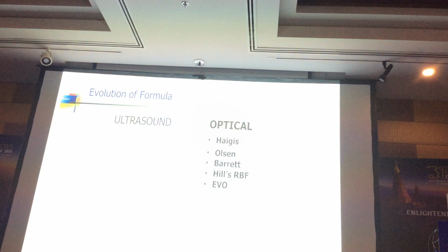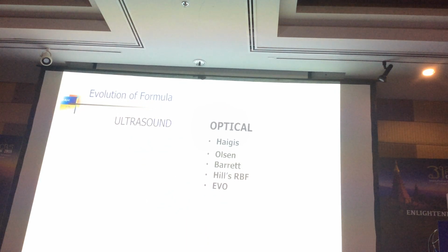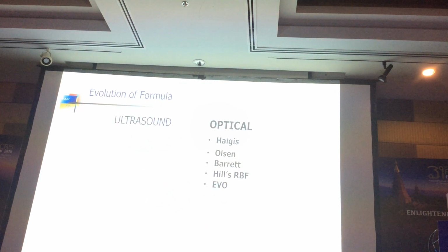optical, and you have to go back to ultrasound? In that case, Barrett, we have data, but I don't have time to show you. Barrett, Evo is not a problem. It will not be as accurate as optical, because fundamentally the data is not as good as optical, but they can be used for ultrasound.